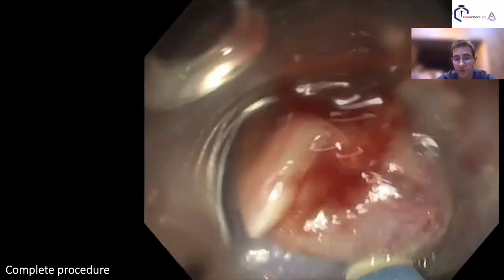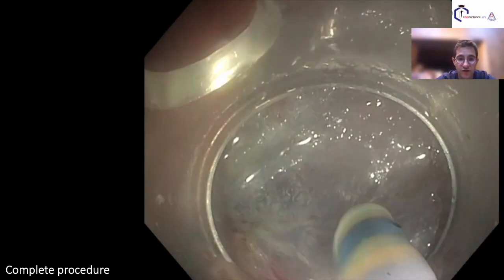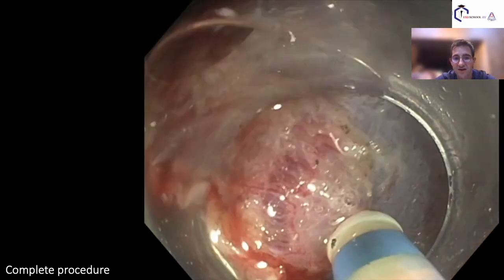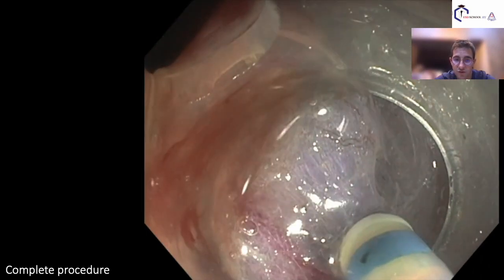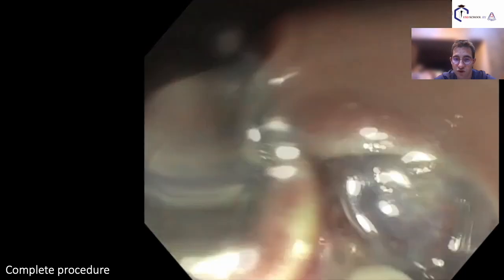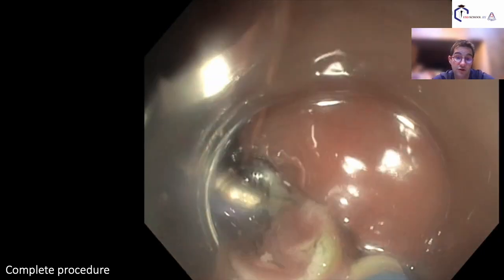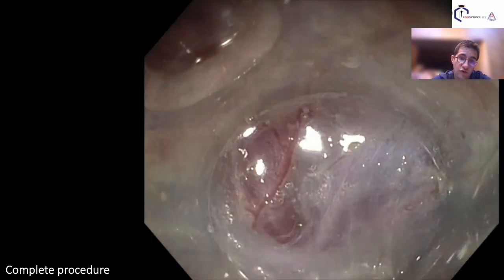They are bigger, but you have fewer vessels, and it's easier to manage and to control few vessels with a large size than many small ones that make oozing. So dissecting very close to the mucosa is really more difficult than dissecting very deep close to the muscular layer. Here you can see the vessel that is dividing in the submucosa, so coming by a large trunk from the deep submucosa, and after dividing in many branches that are thinner but that can bleed a lot if you damage them. So the best probably is to go deep and to control this kind of vessels.